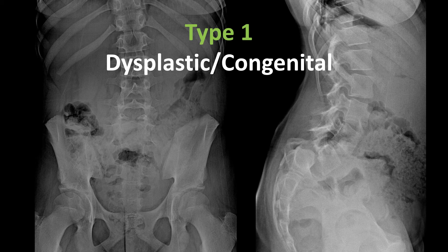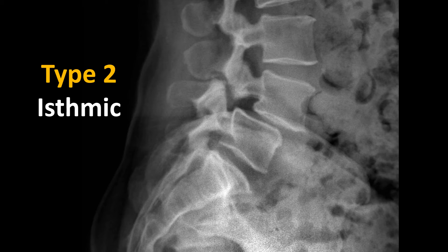Here you can see L5 in relation to the sacrum. The underlying abnormalities posteriorly — failure of development posteriorly — lead to a very severe spondylolisthesis. A type 2 anterolisthesis is one of the more common types and occurs due to an alteration of the pars interarticularis, typically a stress fracture.